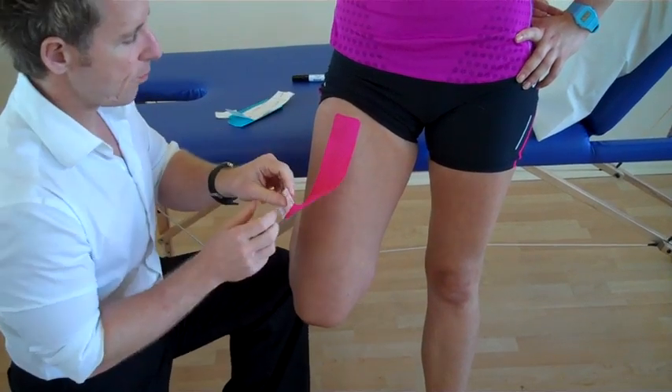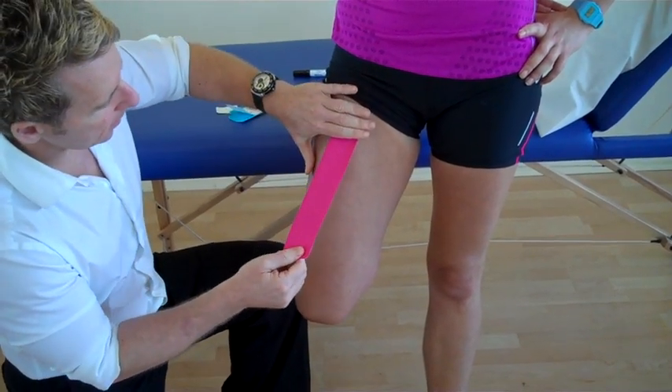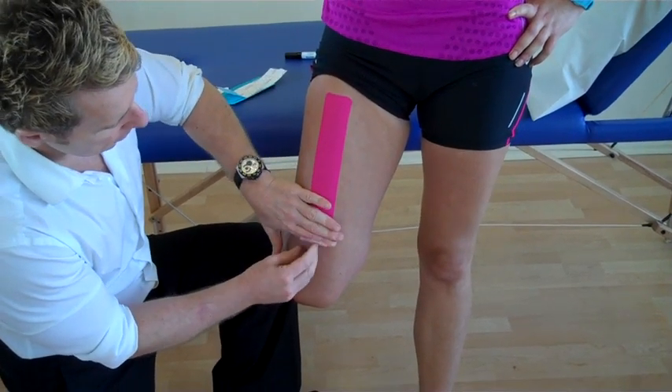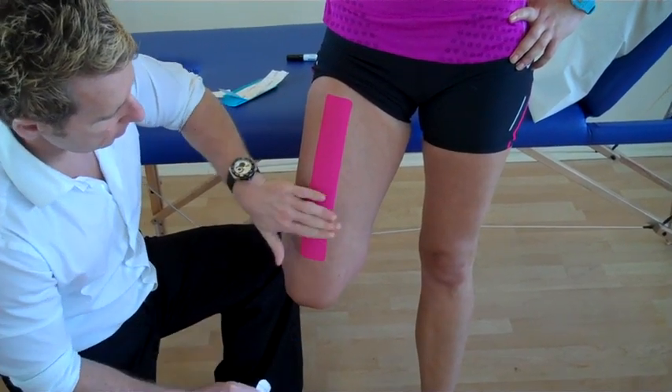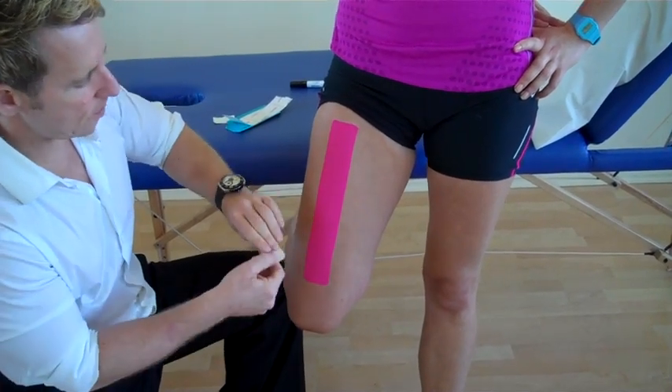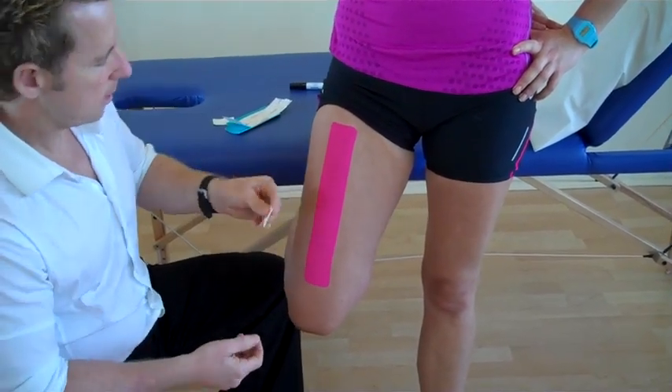And because the tissue is already on stretch, we can apply a little bit of stretch, but we don't need to apply too much coming down. Then the last bit we can just feed out, and warm up using your hand over the back of the adhesive tape.